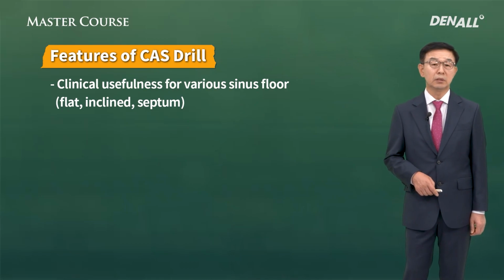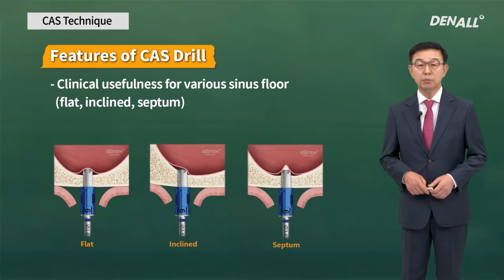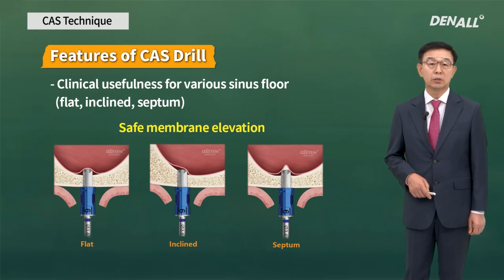Benefits of the CAS drill. You can use this for the crestal approach, not just for a flat sinus floor, but in inclined areas and where septa exist, without membrane perforation.